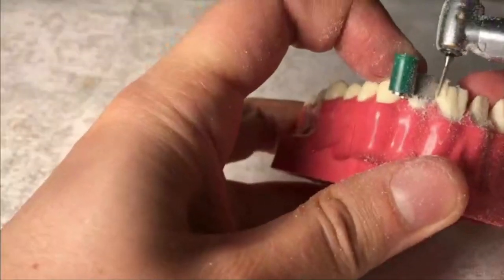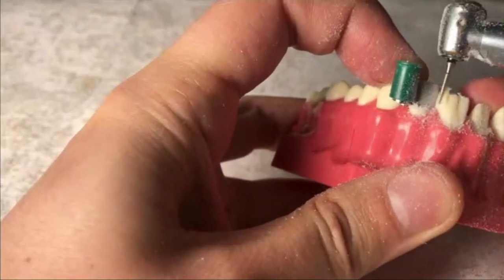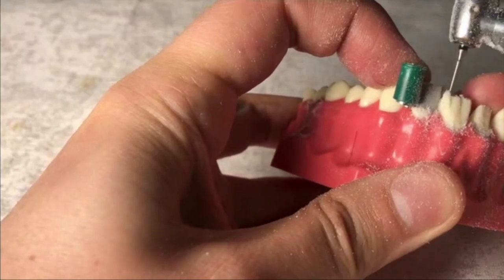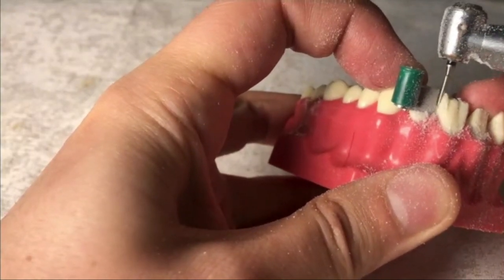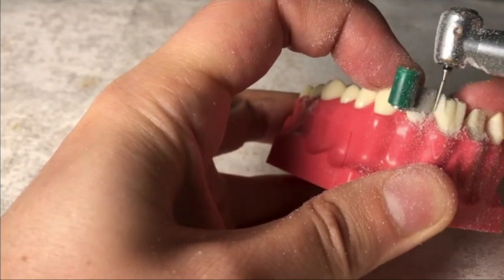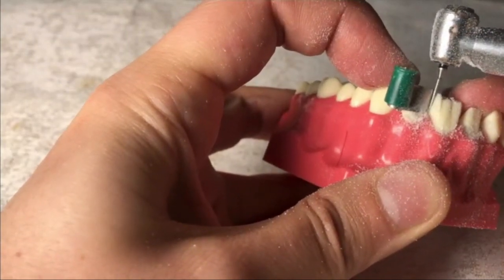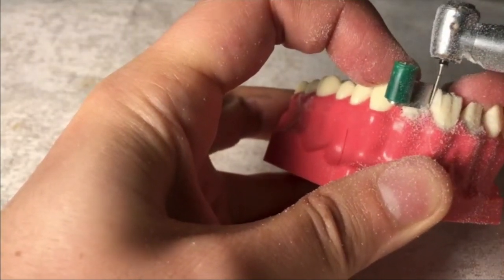Then we insert the flame end burr into the angled handpiece and remove the axial wall. While removing this area, I move the burr slowly back from buccal to palatal. Even if the matrix band is attached, if you are uncontrolled, you will damage the adjacent tooth.